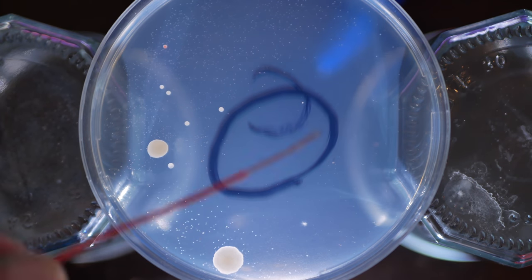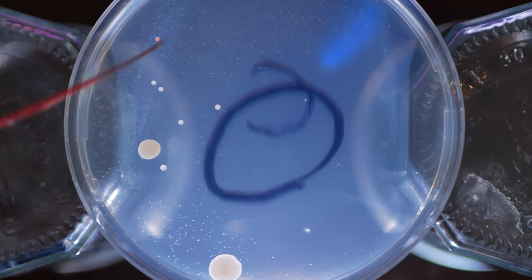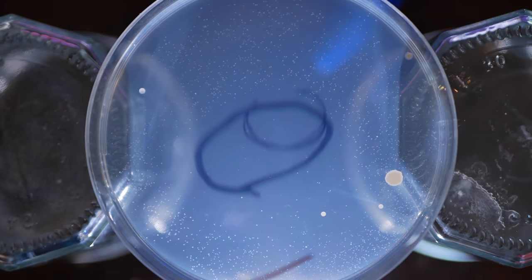I circled the area I treated, and you'll notice, compared to here and here, there's no bacterial growth. There's growth outside of that, but not inside the circle. Same thing for the second plate. There is growth outside of that circle, but in the treatment area, absolutely no bacterial growth.